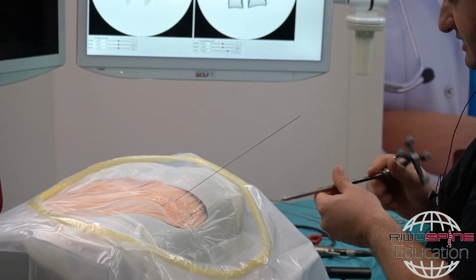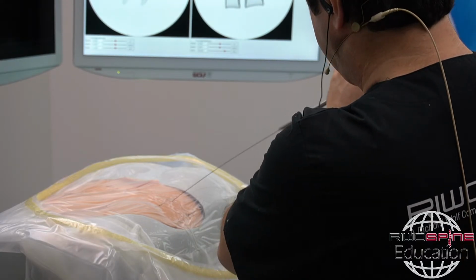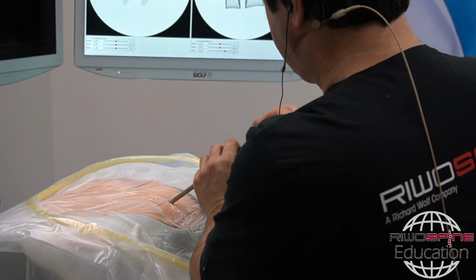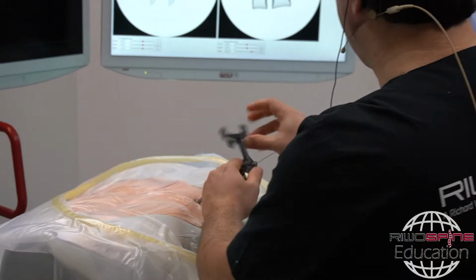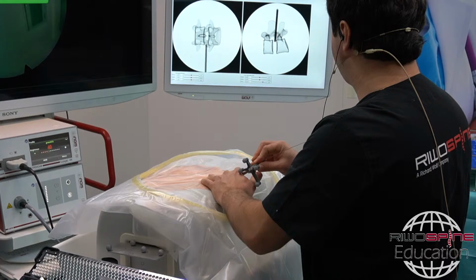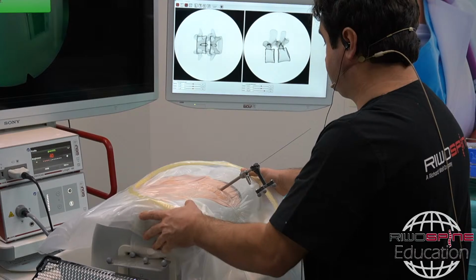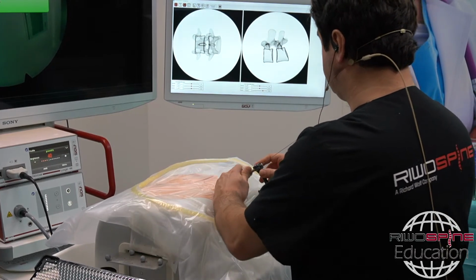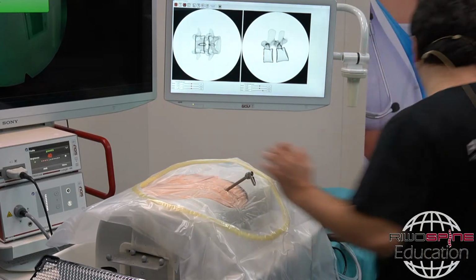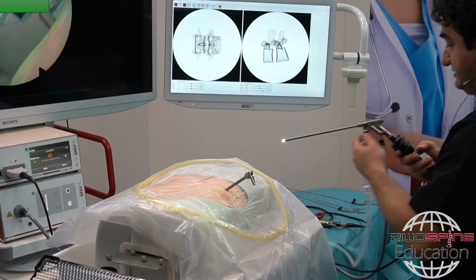Okay, in this case, I would like to do it together with the dilator, otherwise I cannot place the sleeve. Okay, when I'm there, I remove it. Then the next step is starting with the endoscope.